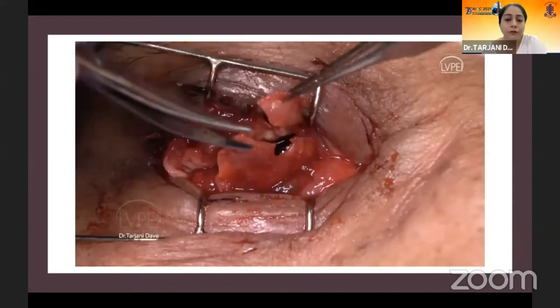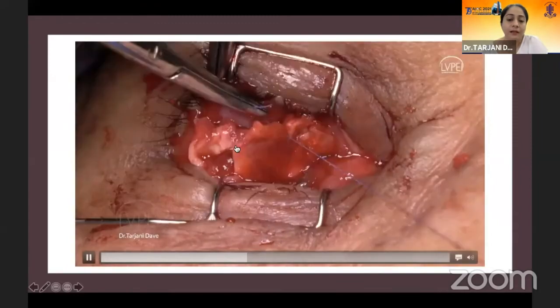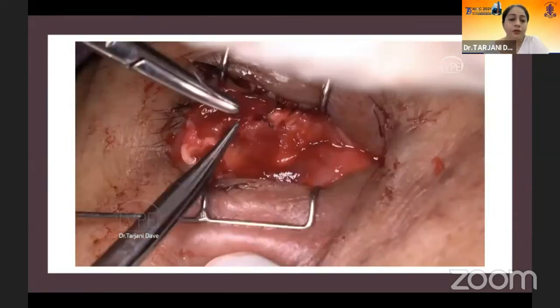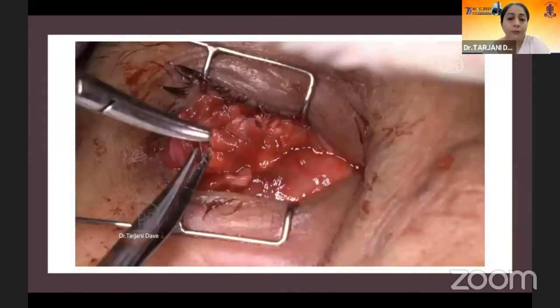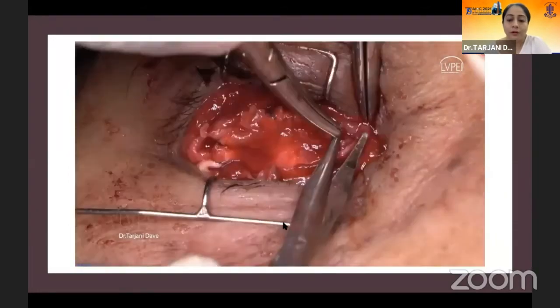This was removal of the necrotic sclera. You see that implant which was placed inside secondarily, along with closure. You tend to retain as much tissue as you can, even if the wound edges are ragged, they heal beautifully. Conserving tissue becomes very important in this situation.